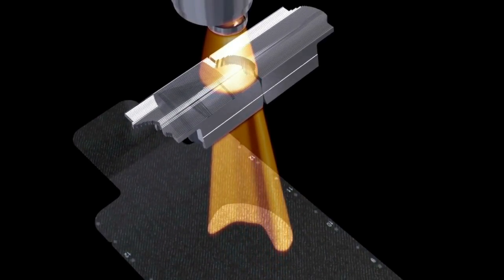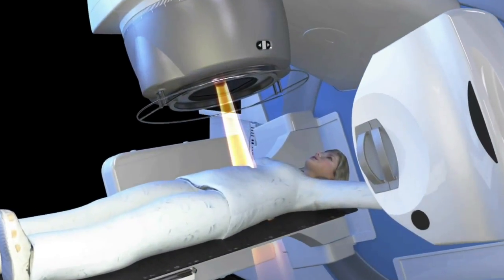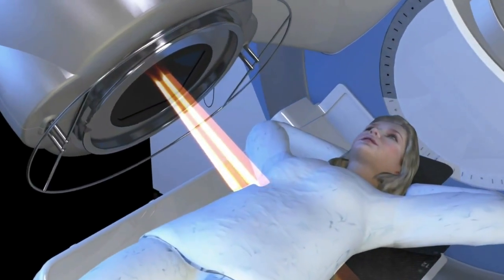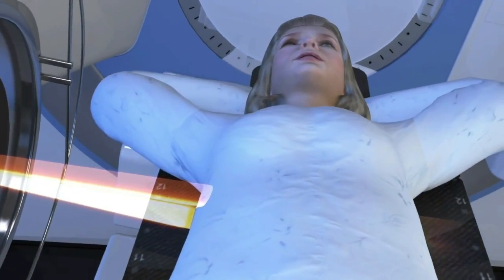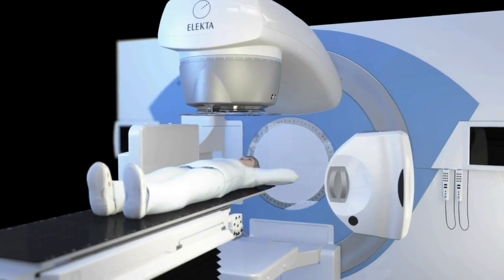Together, the MLCs can shape a beam to conform to many kinds of tumor shapes being treated. The beam comes out, penetrates the patient, and then the linac goes around the patient to give out more shaped beams, which all end up intersecting where the tumor is. This way, most of the beam is focused around the tumor, sparing the nearby normal tissue.